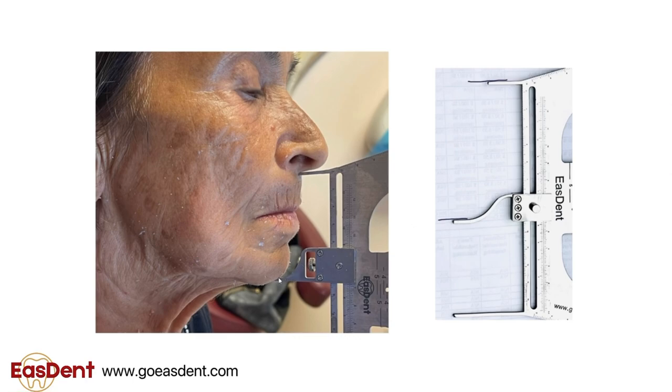The width of the movable stick is 2 mm. Therefore, the bite position is 2 mm less than the preset VDO. This 2 mm room is left for the thickness of the final impression material. If your final impression material is thick, it will raise the VDO a little bit. Thick final impressions happen a lot, especially for beginners. Your final impression thickness may not raise the VDO exactly 2 mm.